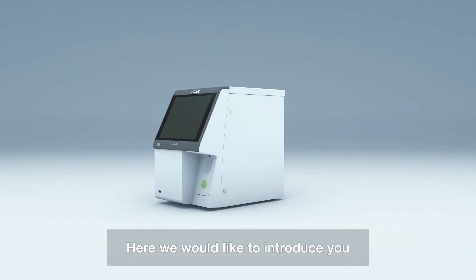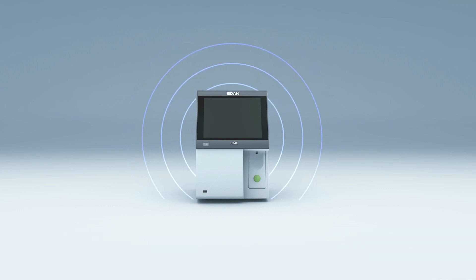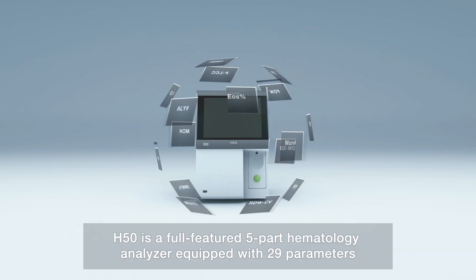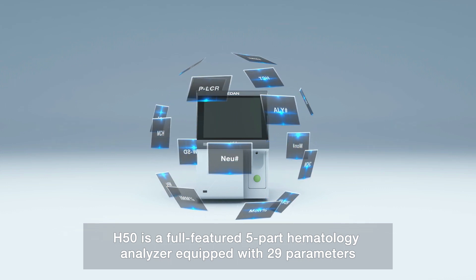Welcome to EDAN. Here, we would like to introduce you to our new generation of 5-part hematology analyzer, the EDAN H50. H50 is a full-featured 5-part hematology analyzer equipped with 29 parameters.